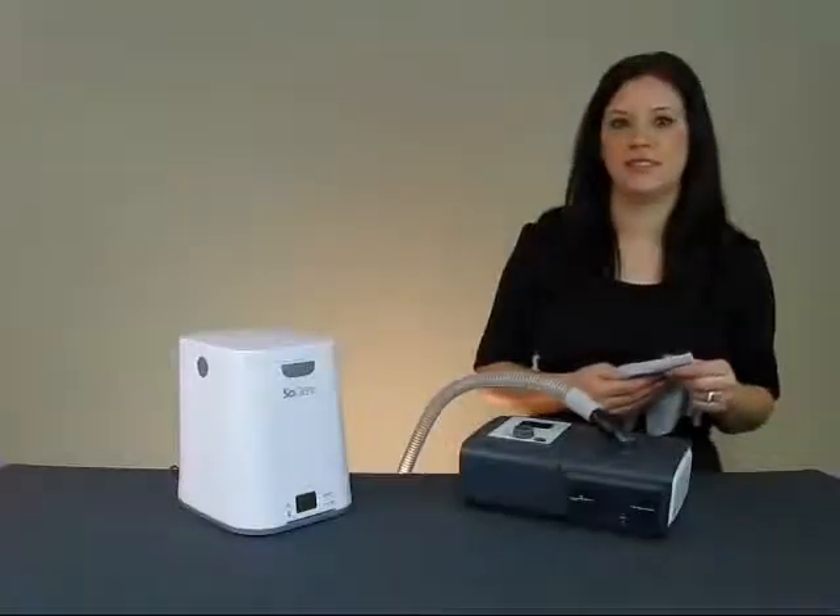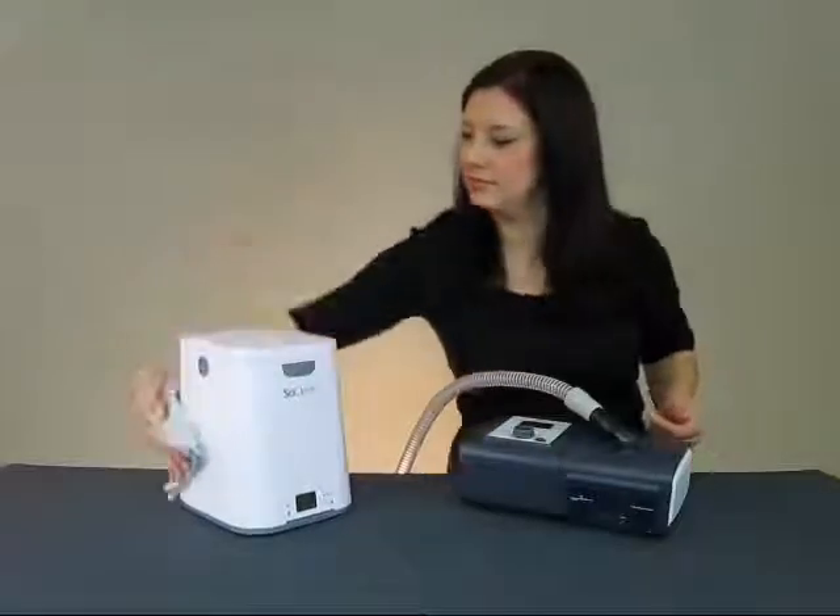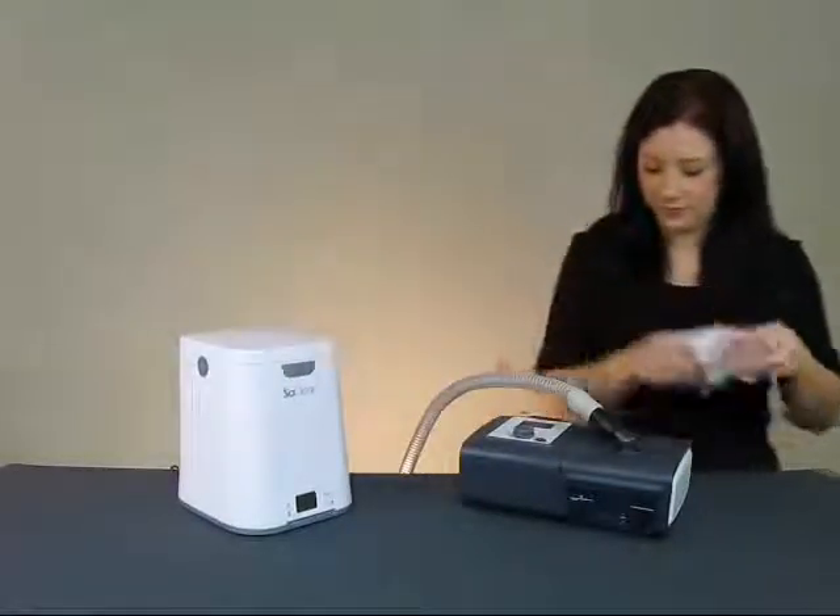Very little is needed when it comes to looking after your SoClean. Keep it clean and dust free by wiping it down with a damp cloth when necessary.